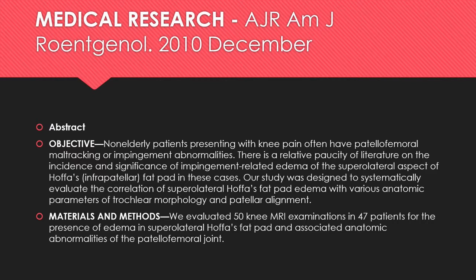So we have some findings for patellofemoral involvement due to patella alta. And we also, on the prior MRI studies, had several other significant findings, such as some cysts in the posterior cruciate ligament. There was some edema noted in the infrapatellar fat pad, and there were some other findings as well. Well, can these findings all be tied together? Is there some condition that can explain the conglomeration of all of these findings?